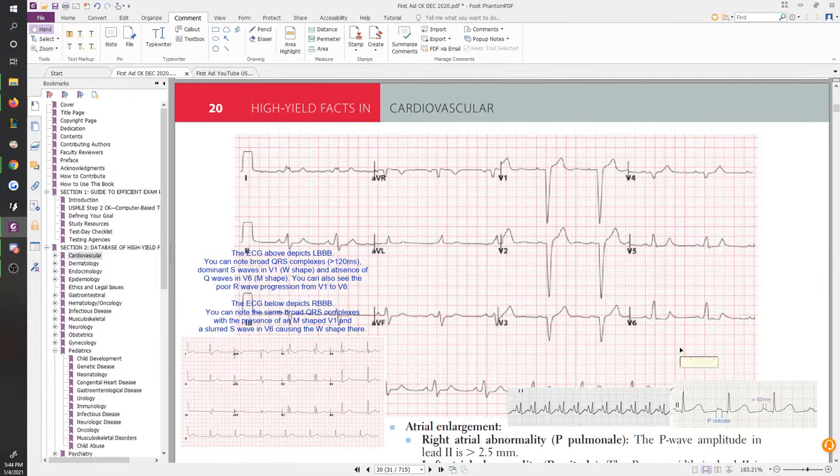So one of the special things that I like to employ is the idea that you also want to look for what you don't see. So if you don't see an M in V1, then there might be an M in V6, and now it comes down to really convincing yourself of that. There's no way you can draw an M in this V1. There's no M to draw in V1 because V1 is actually appropriately pointing downwards. So then it's actually possible that there might be some kind of weird W here. It's easier for me to impose a W onto that than an M.